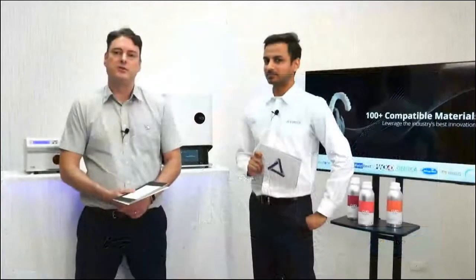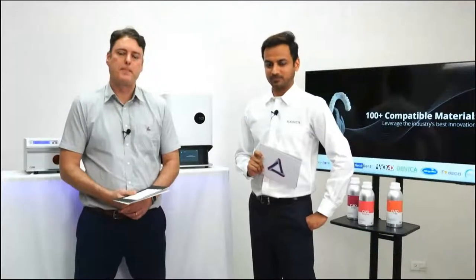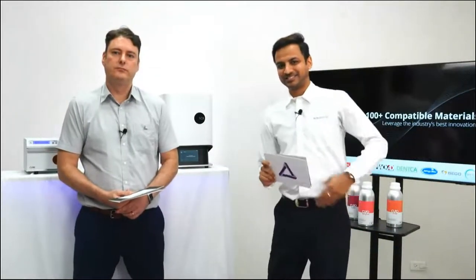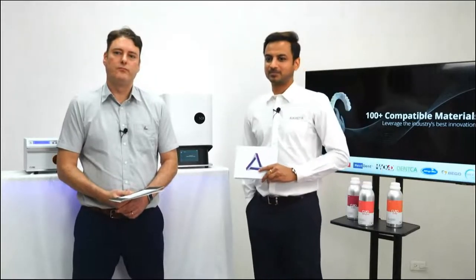We have another question, please, Jose. We have one last question, or almost the last question. Georgiel Trifonov is asking, is it possible to change the curing settings? Okay, for the sole, not really. We prefer that you don't, because we control the entire ecosystem. For the Dantic, yes, it's open. The users can change the settings, but not for the sole.